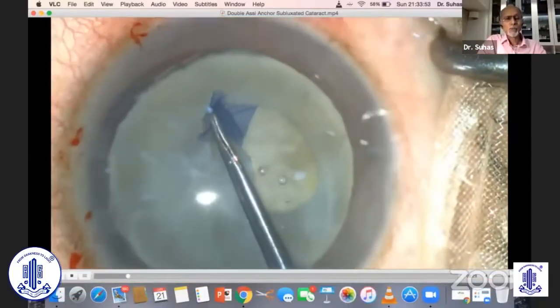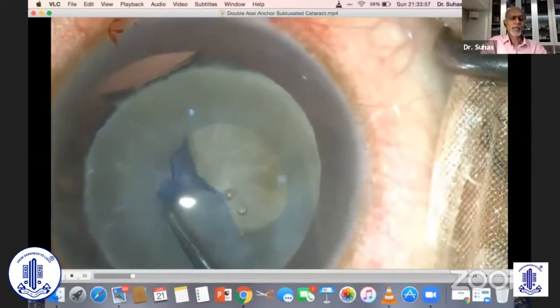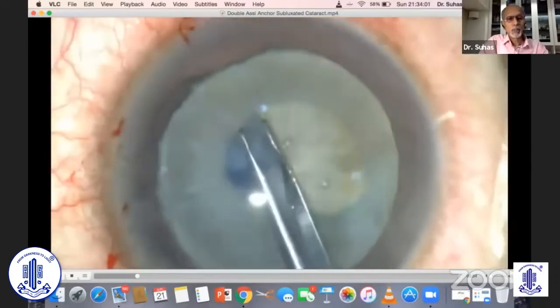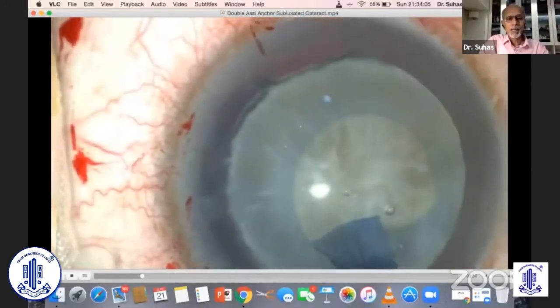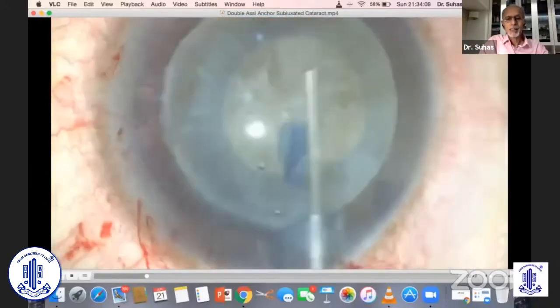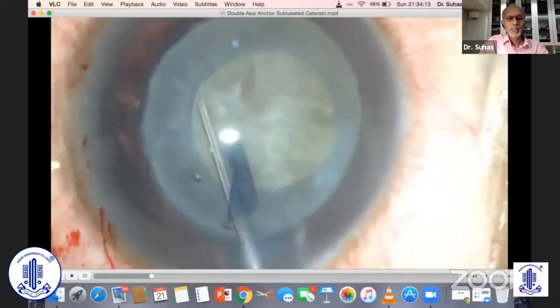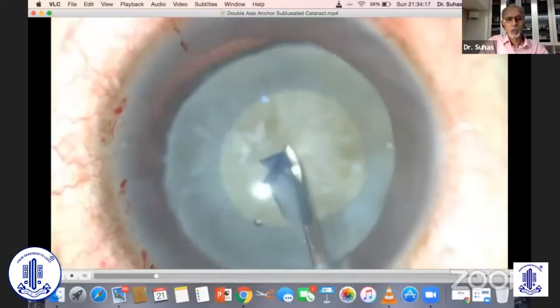When you make your rhexis, at times it's difficult, and you may have to use hooks to support counter pressure. But luckily, after injecting dispersive viscoelastic very gradually, I could make one. However, you'll notice the capsule is so firmly stuck on the nucleus.